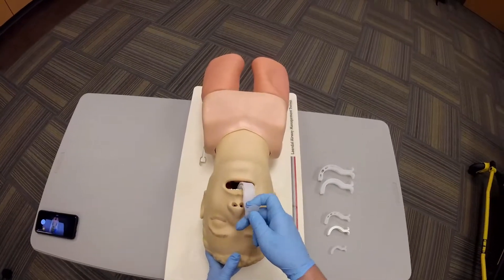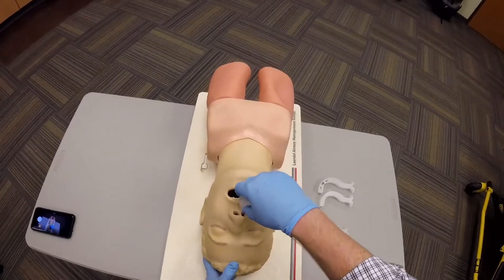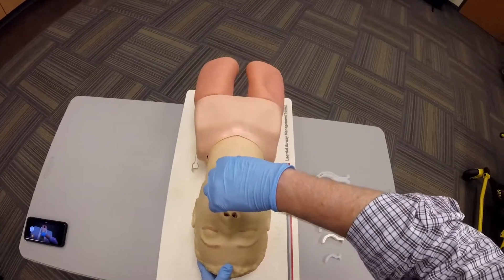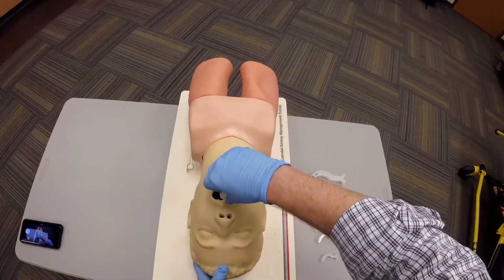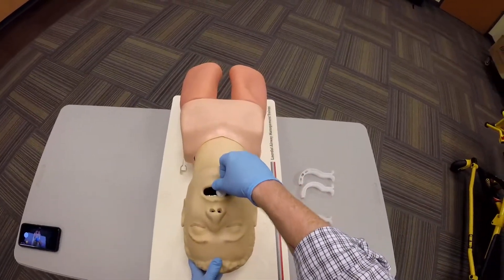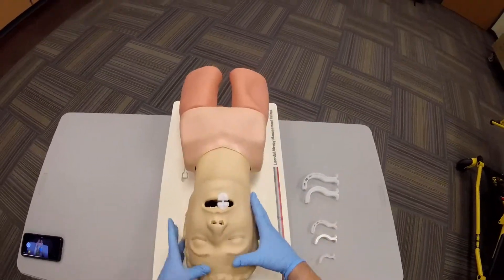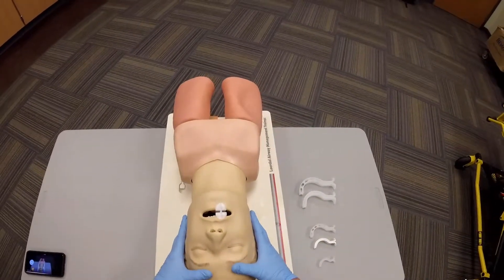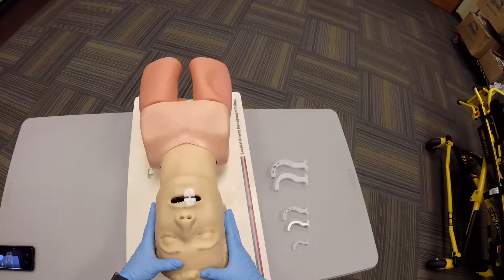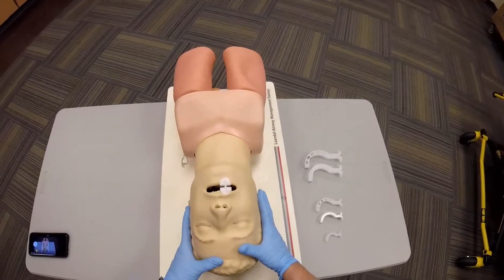I will follow the top of the mouth until I meet resistance. At that time, I will twist and insert to sweep the tongue out of the way. I will assess for a gag reflex and maintain an airway.